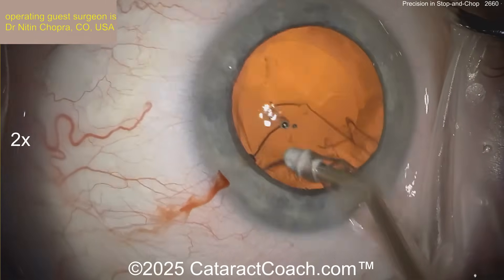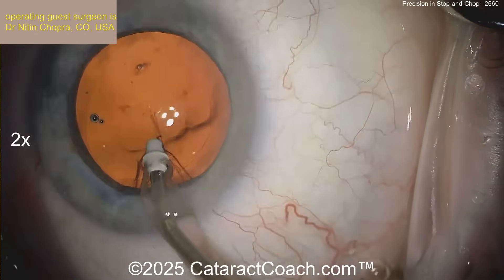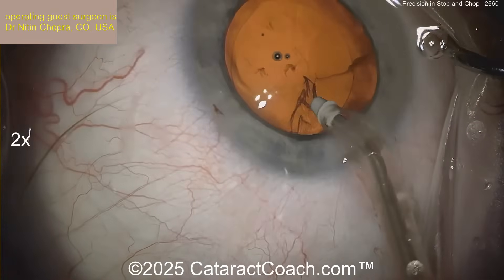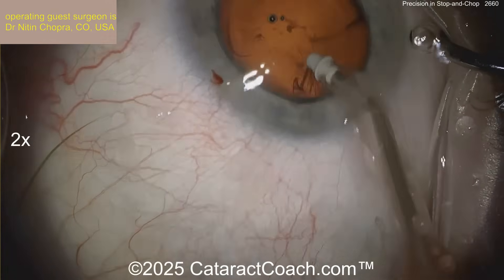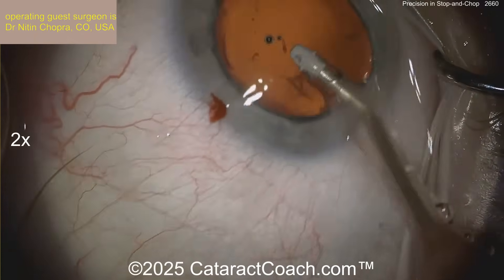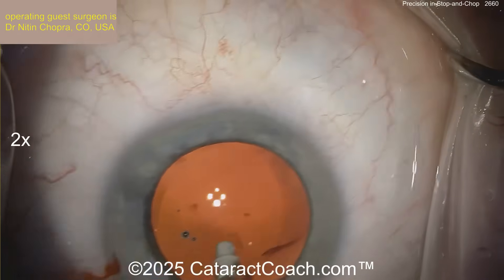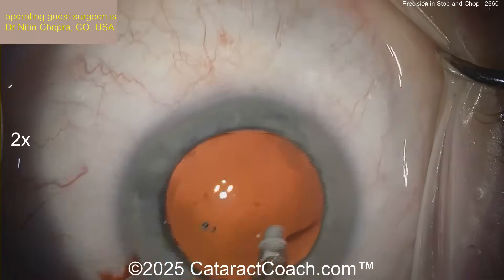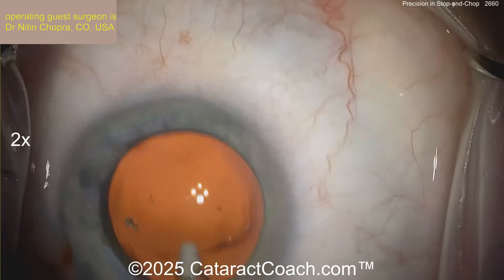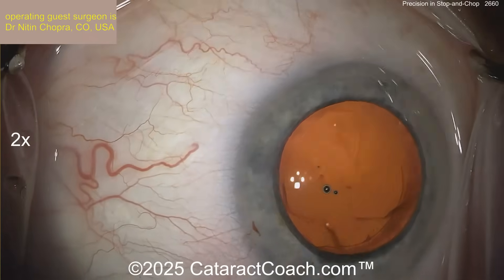Back to this case — cortex removal going very efficiently here, stripping centrally. The back looks really nice and clean. Beautifully done. There's the outline of that rhexis — rhexis looks good. This is the one time I tend to get the eye out of primary: when you access that sub-incisional cortex. Using coaxial instrumentation like this, you tend to have to move the eye a little bit. With a bimanual approach, you can keep the eye in primary the whole time and may find it even easier to access sub-incisional areas.